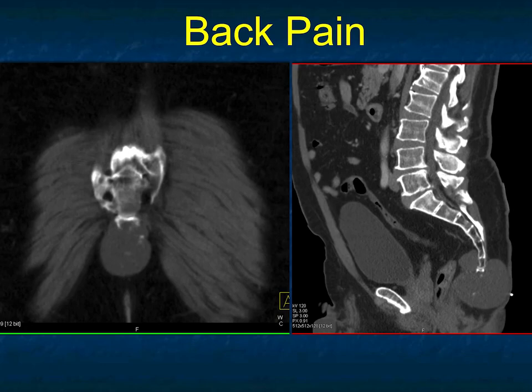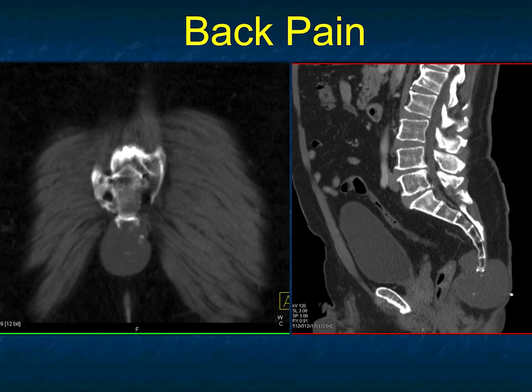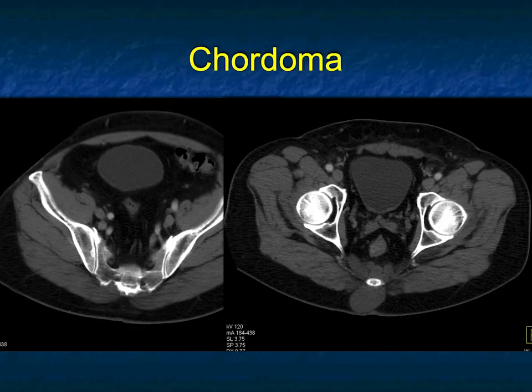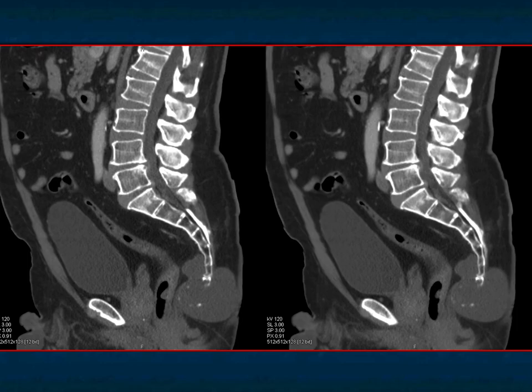This patient has back pain. You look and there's a soft tissue mass by the coccyx — it's destructive. It could be metastasis or recurrent rectal cancer, but there's no tumor in the rectum here, and that's usually direct extension, and you see bone destruction. Things that involve the lower sacrum or coccyx — you always have to think about chordoma. Chordoma can cause bone destruction, it's a soft tissue mass, and the mass usually is not very enhancing, but location — the sacrum and coccyx — is a great location. The differential includes giant cell tumor, metastasis, and lymphoma, but location is everything. It's real estate, and it's in tumors as well. The end diagnosis was chordoma, nicely shown on the sagittal view.